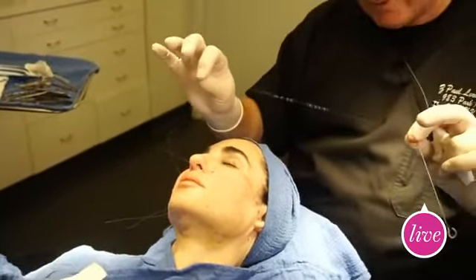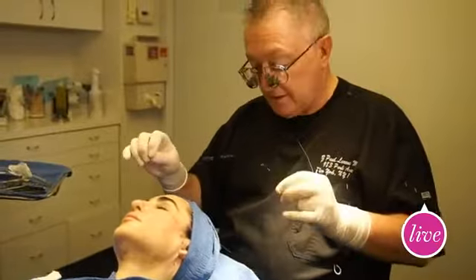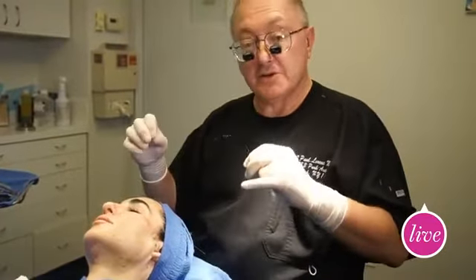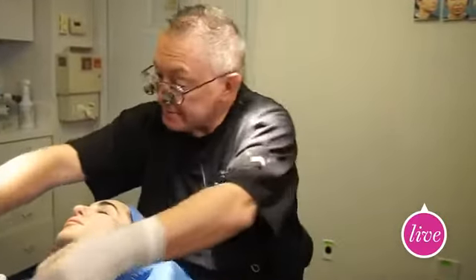Because all of this material, the suture and the cones themselves, are completely bioabsorbable. So your body, as it processes it, stimulates collagen type 1, which is a good collagen. So you volumize the face, you have changes in the quality of the skin, it looks radiant, the pores get smaller. Okay, amazing. So that's how it works.